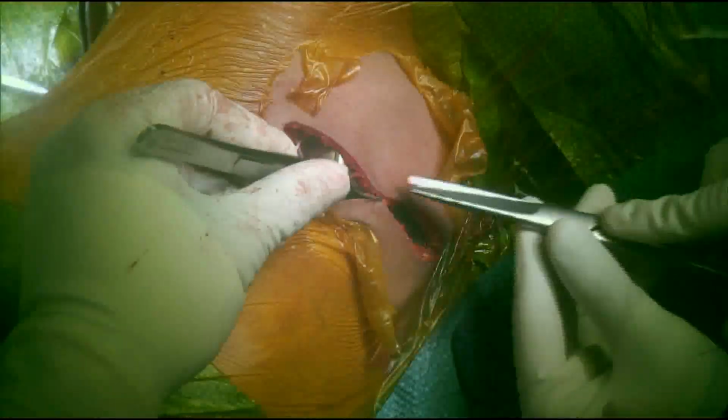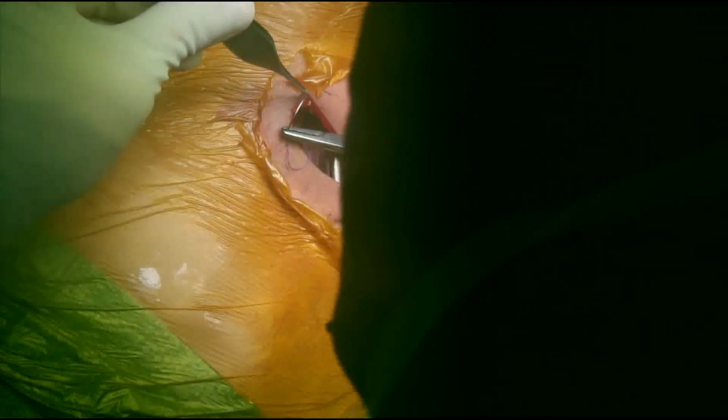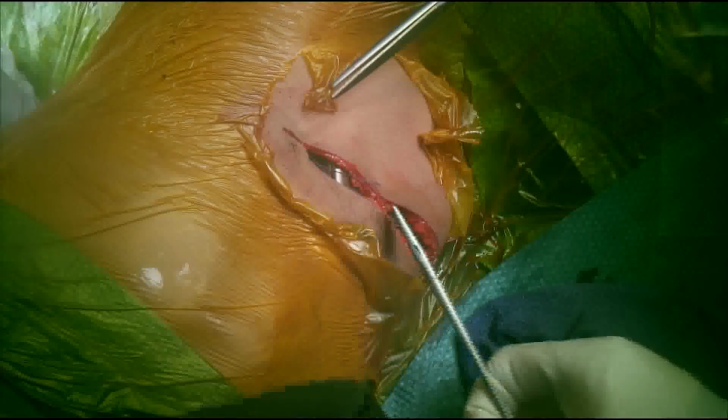As we are watching, I would like to remind you of some of the post-operative considerations which you need to keep in mind for baclofen pump patients. In the early post-operative period, you should ensure that the wound is checked every few days. Do not expose the wound unnecessarily unless it is soaked or significantly soiled.